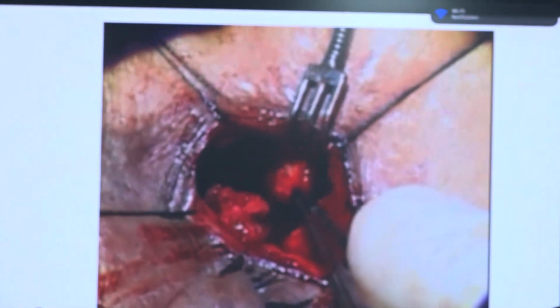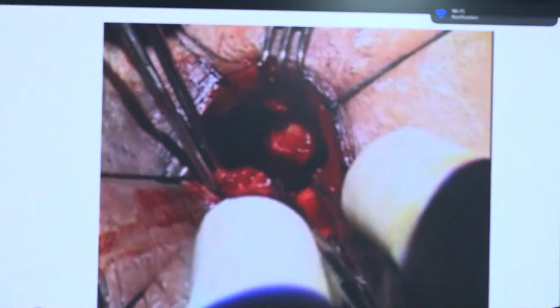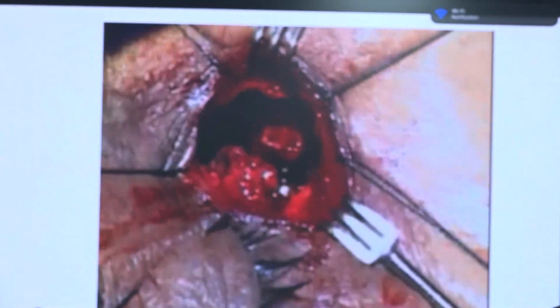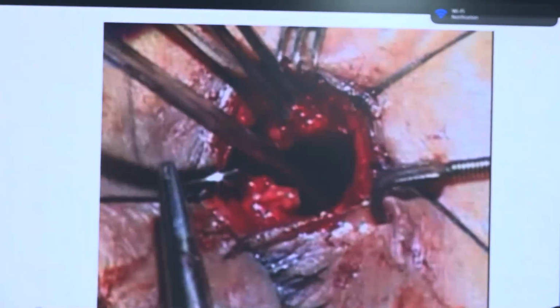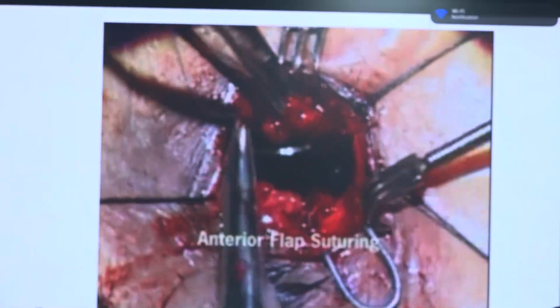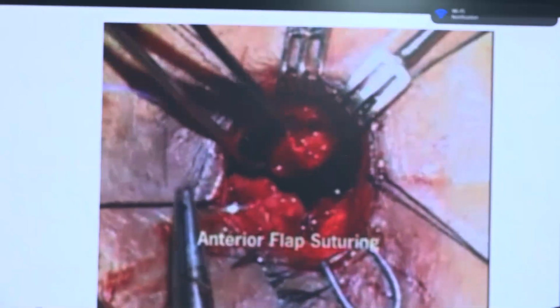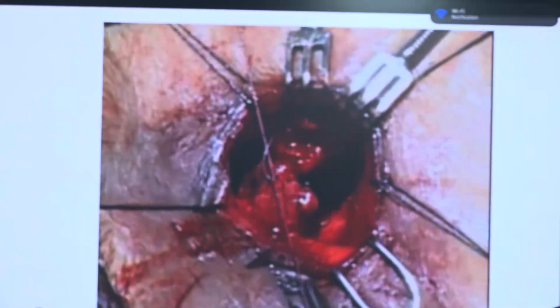The 2 anterior flaps are now seen here, and the anterior flap sutures are next passed. The sutures in the flaps are always passed, starting with the lacrimal mucosa first, as the mucosa is more sturdy than the nasal mucosa and does not cut through easily.